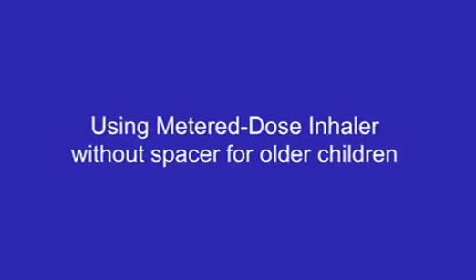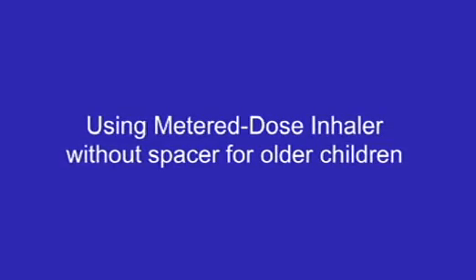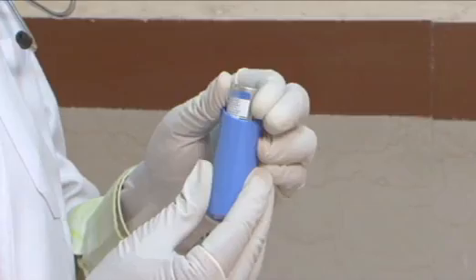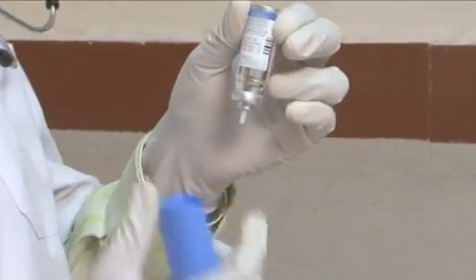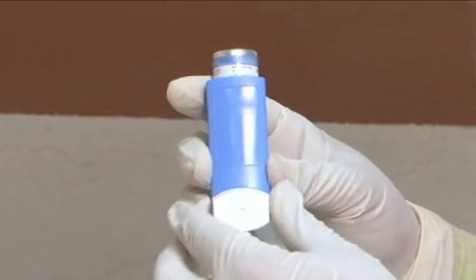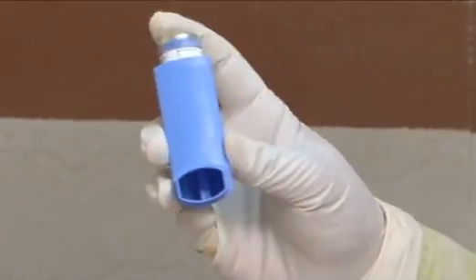Using metered dose inhaler without spacer for older children. Check the expiry date on the canister. Remove the cap from the inhaler and shake the inhaler well.